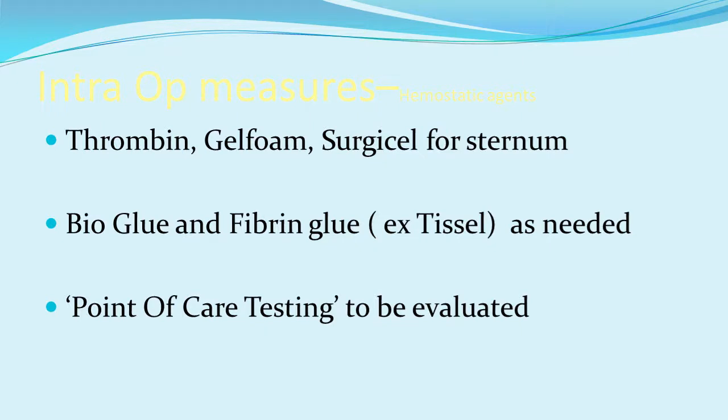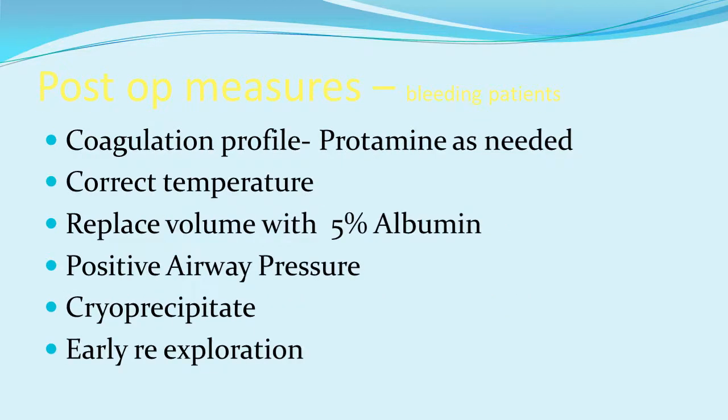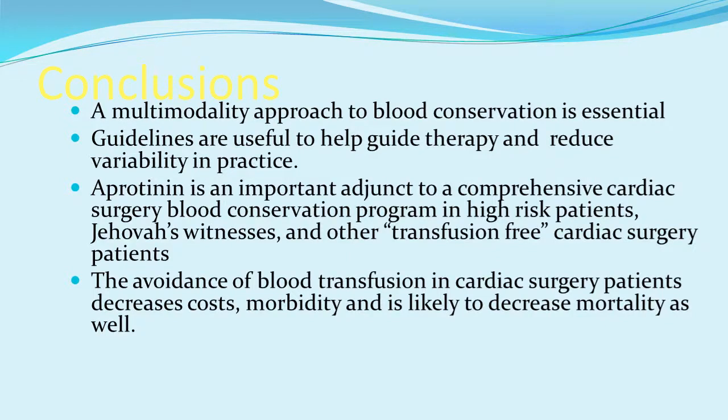Intraoperative measures: thrombin, BioGlue, and point of care testing. Post-op measures for a bleeding patient: coagulation profile, correct temperature, replace volume, positive airway pressure, and cryoprecipitate. Conclusion: a multimodality approach to blood conservation is essential.